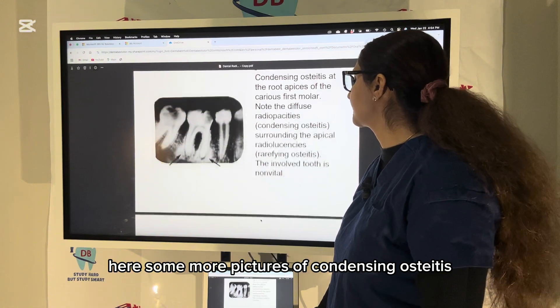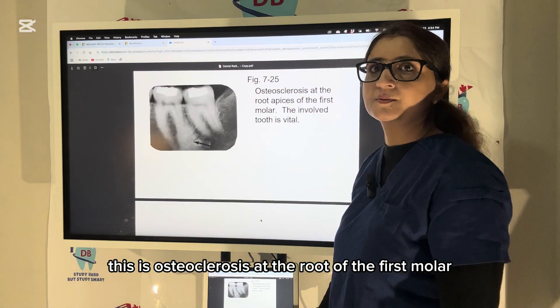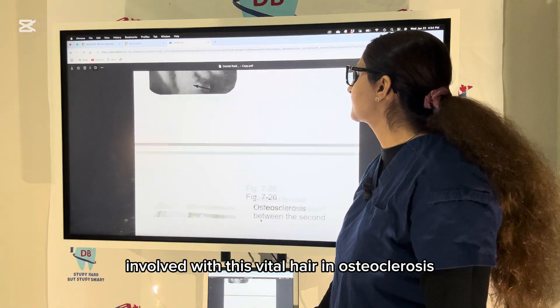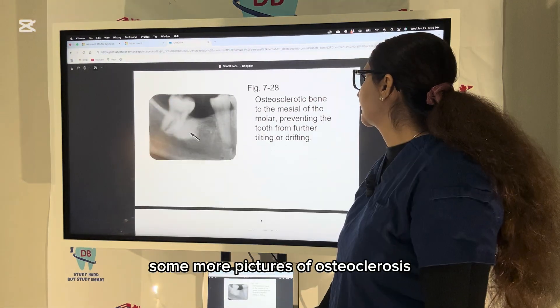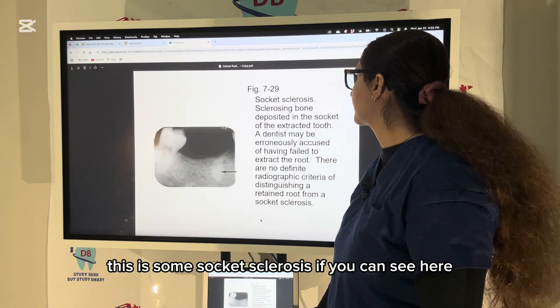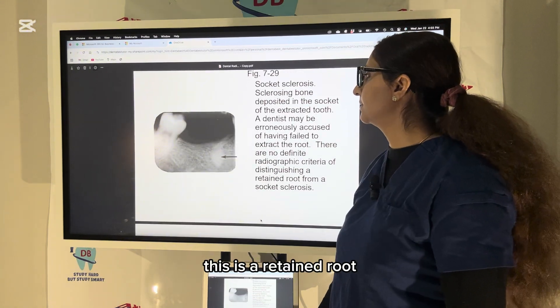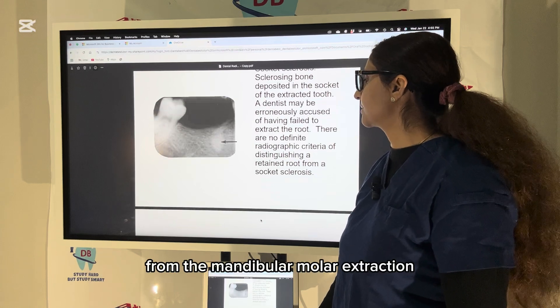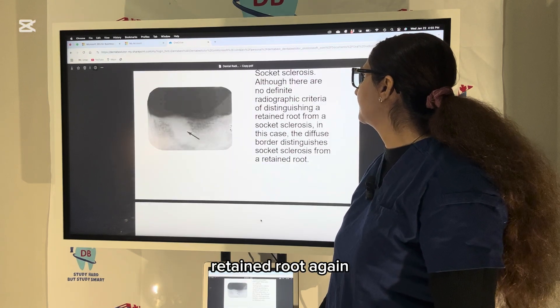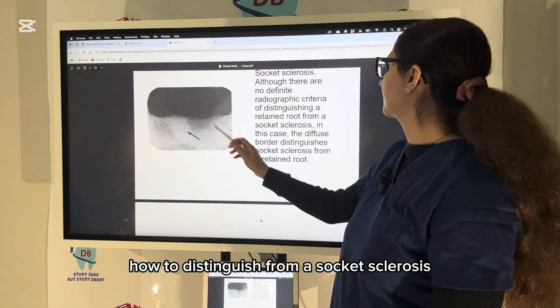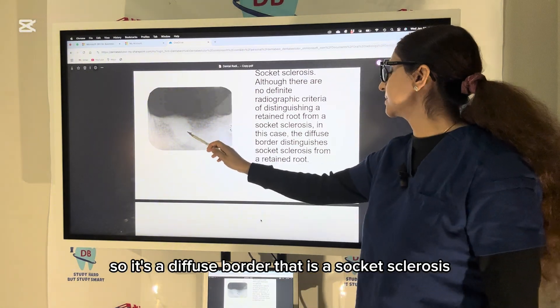Some more pictures of condensing osteitis. This is osteosclerosis at the root apex of the first molar; the involved tooth is vital. In osteosclerosis you can see some more pictures. This is socket sclerosis — here we have a retained root from a mandibular molar extraction that leads to socket sclerosis.